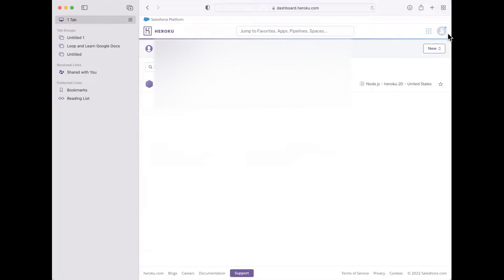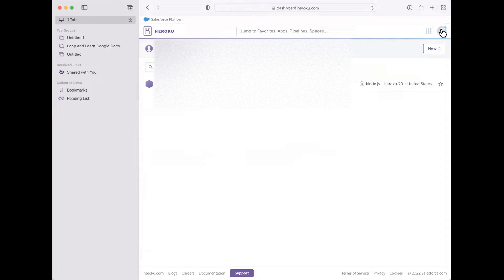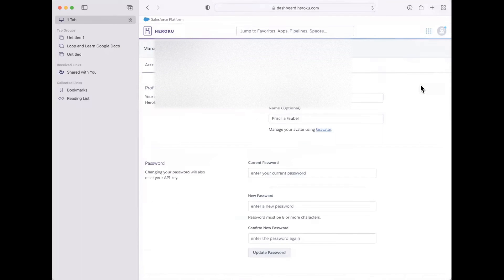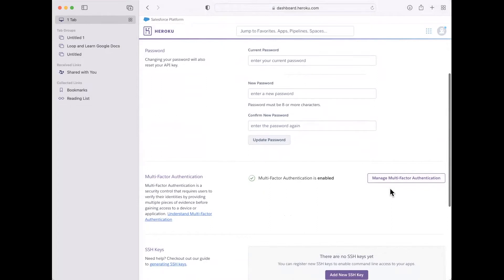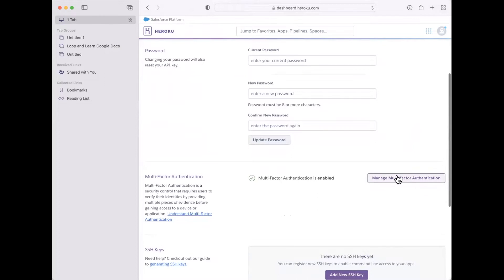You go to your little icon here, click account settings, and then look for manage multi-factor authentication.